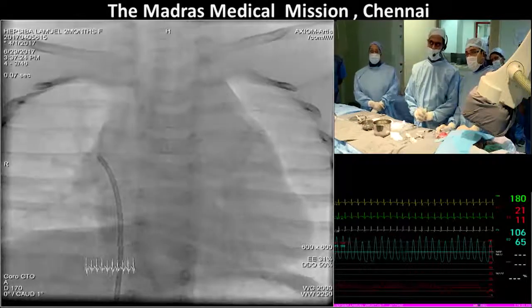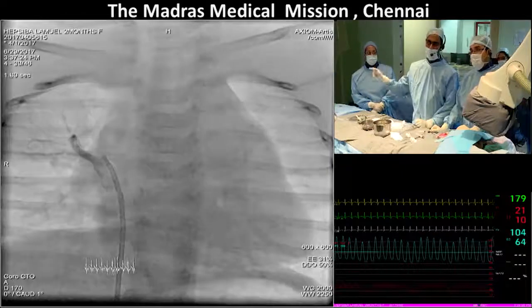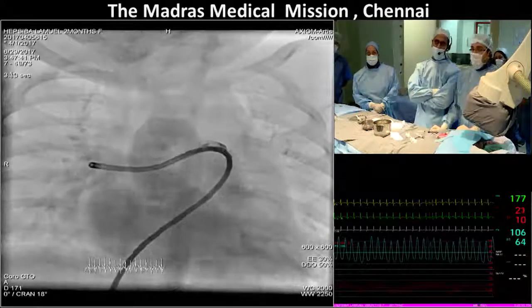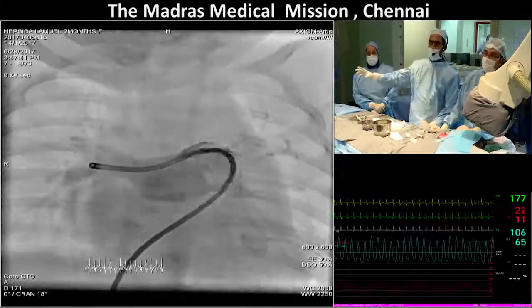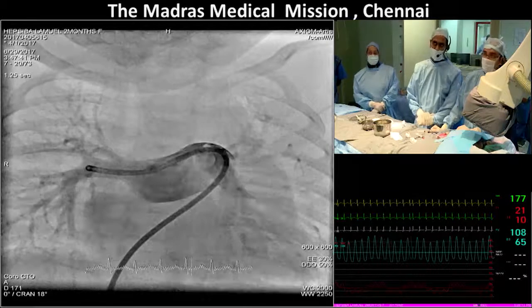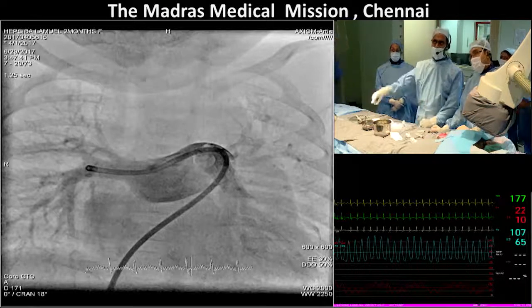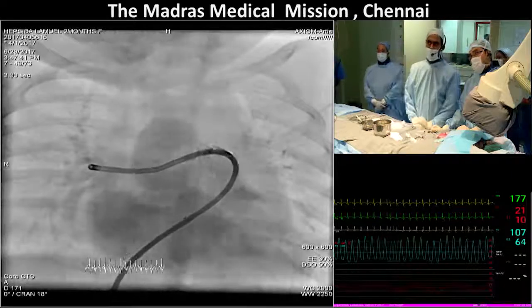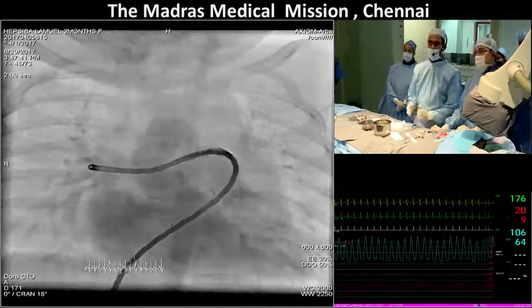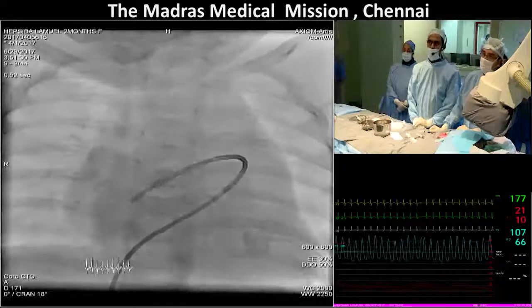However, the portion of the left atrium near the region of the right pulmonary veins was aneurysmal. Next picture. So then we took a catheter into the main pulmonary artery, freeze the frame. So we can appreciate the whole of the main pulmonary artery is significantly dilated, and from the lower surface of the right pulmonary artery, there is a communication that goes and fills the left atrium. In order to get a better picture, we pointed the catheter towards the orifice and made another injection.